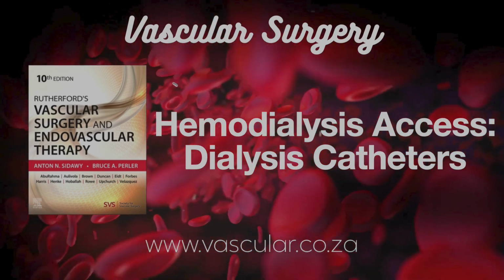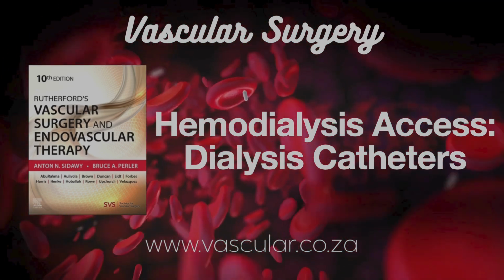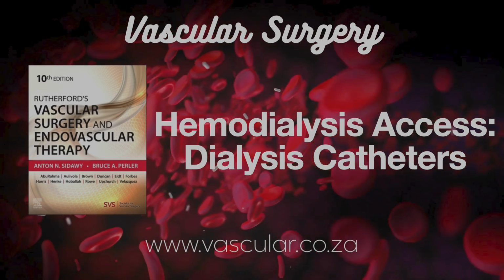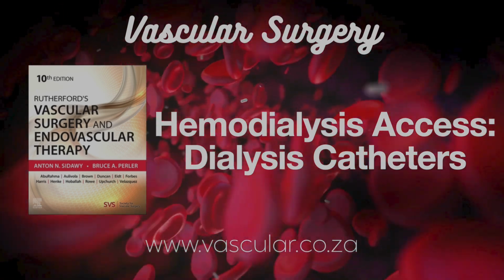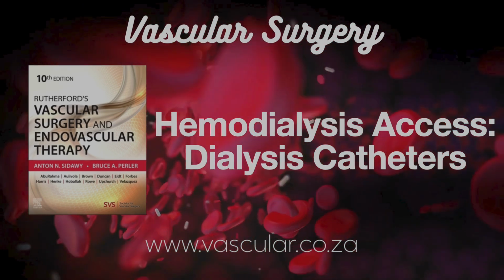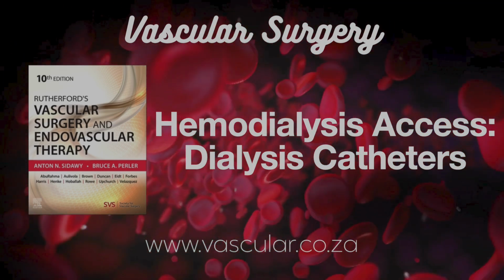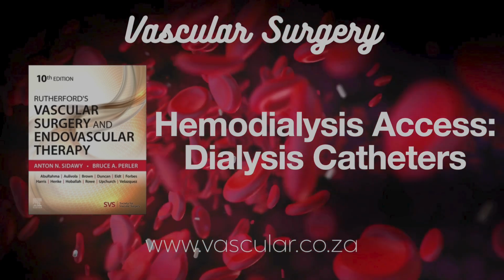What about the heart? Any immediate cardiac risks? Arrhythmias, irregular heartbeats, are rare. Usually it's just the wire tip irritating the heart muscle. Using marked wires and fluoro helps keep the wire out of the ventricle. If it happens after placement, check the catheter tip position on X-ray. Pull it back a bit if it's too deep near the tricuspid valve. Very rarely it needs meds or cardioversion.